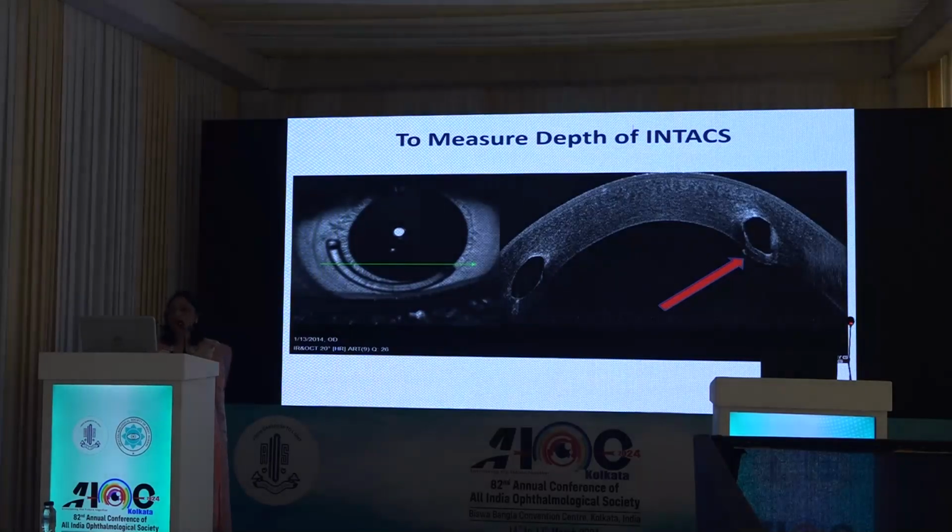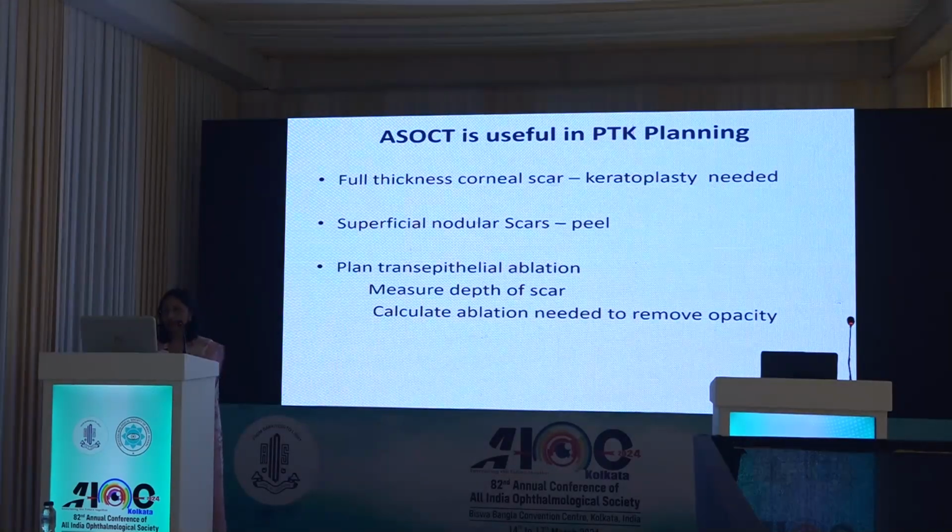Ultra-high resolution OCT can even visualize the intracorneal ring segments very clearly. And you can see if there is any stromal thinning, overlying stromal melt, or early extrusion of the intacs. All these things can help us clinically to manage the patients.